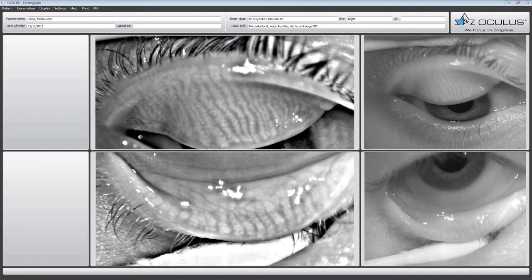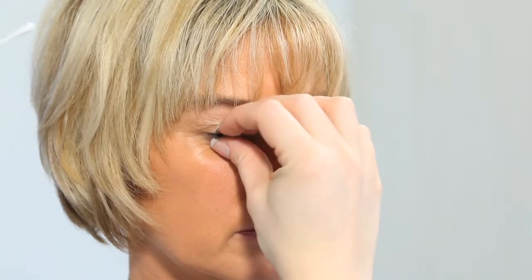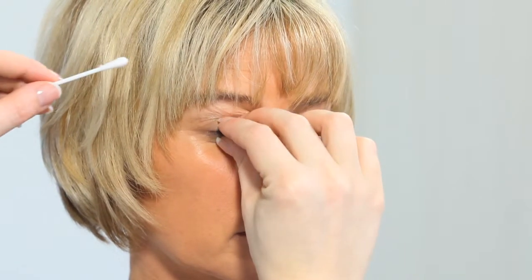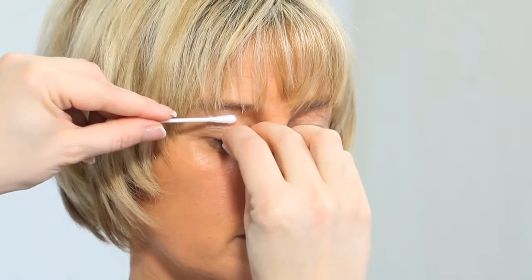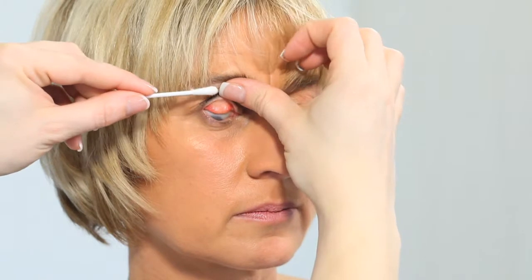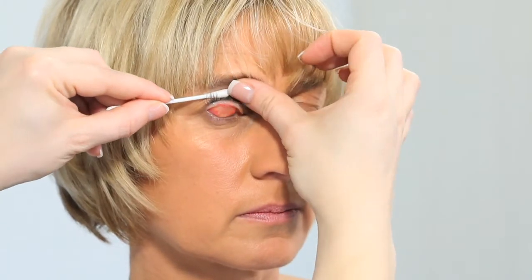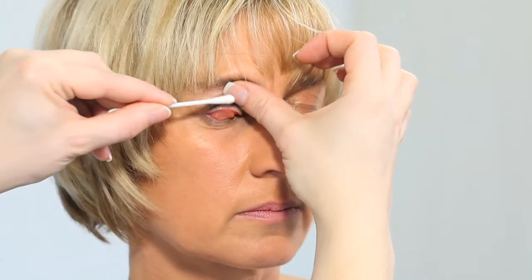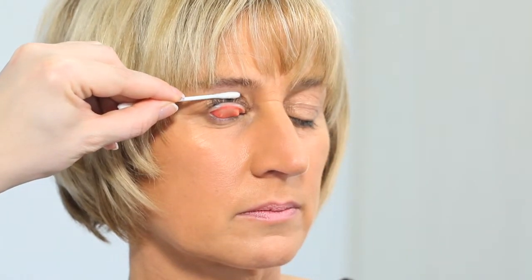To make the meibomian glands visible, it is necessary that the upper eyelid is inverted. Please use the following steps to invert the upper eyelid: Patient looks down with both eyes open. Depress the mid portion of the upper lid laterally using a cotton swab or other blunt instrument. Grasp the lashes of the upper eyelid and lift upward. Upper lid remains relaxed while the patient looks downward.